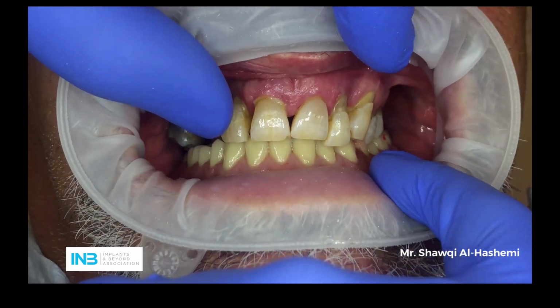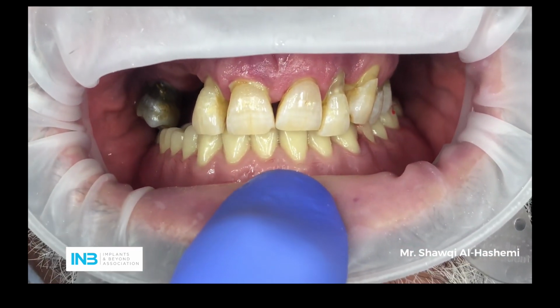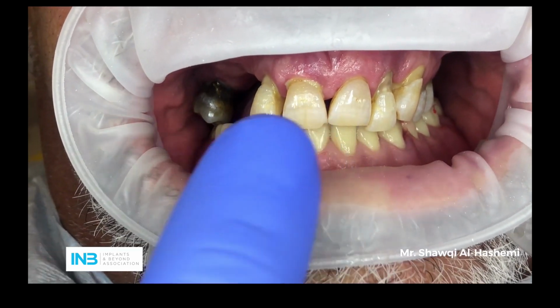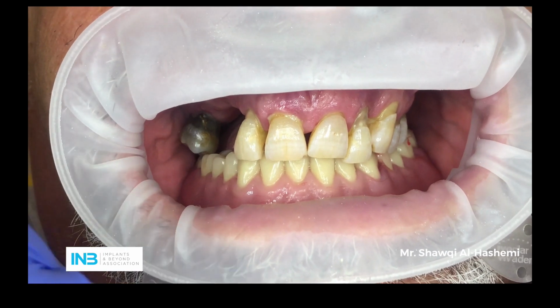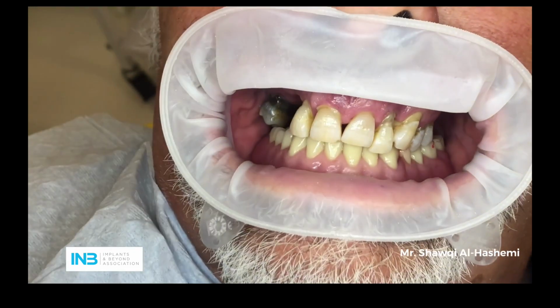So make sure that you really ask your patient to bite for at least 5 minutes minimum. And take a sample of your resin, which I'm going to do, to make sure it is set. Good.